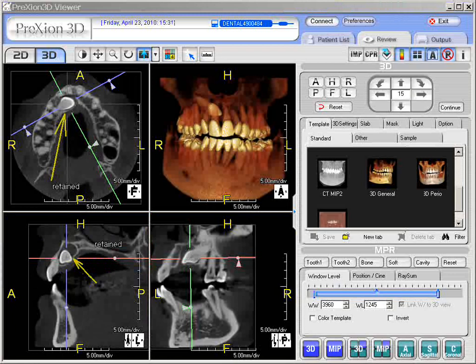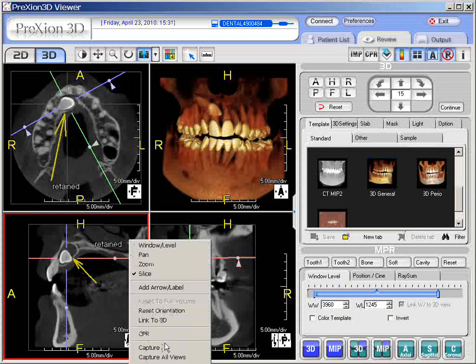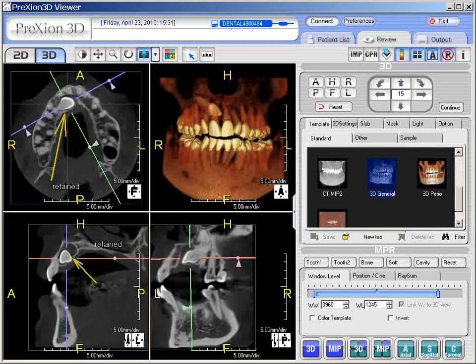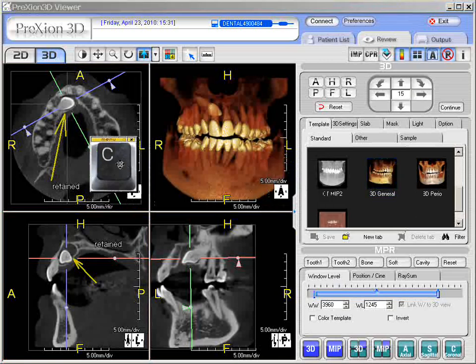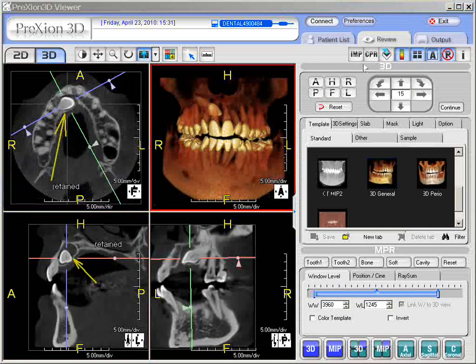If you want to save and capture, we'll talk about this in another section, but you can right-click and select 'Capture.' If you hit capture it will capture just the one screen, or if you want to capture all views it will capture everything on the screen. Alternatively, you can pick the screen you wish and type the letter C on the keyboard. As long as you're in that active screen with the red frame around it, press the letter C once and it will go to the output panel.